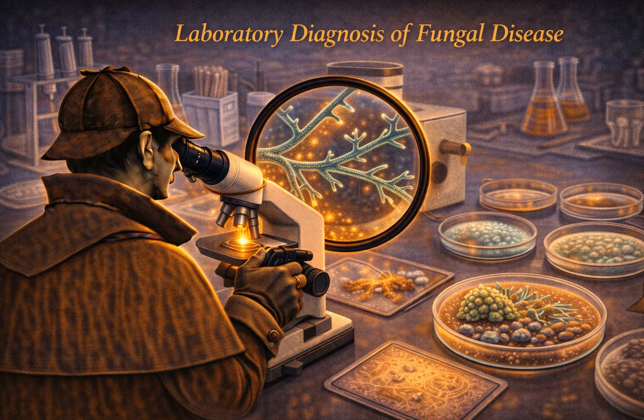Correct. Other really important ones are some species of Aspergillus, like A. fumigatus sometimes, some Candida species like C. parapsilosis or krusei, and crucially, once again, the Mucormycetes, Rhizopus, Mucor. The Mucormycetes again. They are fragile to grinding, and they are fragile to cycloheximide. They are incredibly hard to catch.